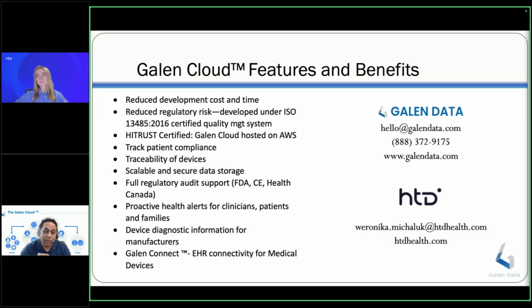I will add that using an LLM is going to make it harder and harder to get into the CDSS category, just because the FDA has tightened what can qualify as CDSS. Conversely, in Europe, because of the AI Act and a bunch of other stuff, it's also very hard to claim that a large language model, or any AI for that matter, doesn't fit into a SaMD category and can get into the CDSS category.